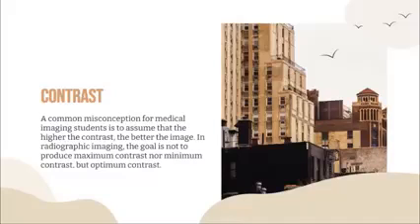A common misconception for medical imaging students is to assume that the higher the contrast, the better the image. In radiographic imaging, the goal is not to produce maximum contrast nor minimum, but optimum contrast. Optimum in the middle lang siya sa high and sa low contrast. Okay? Noise also decreases contrast.